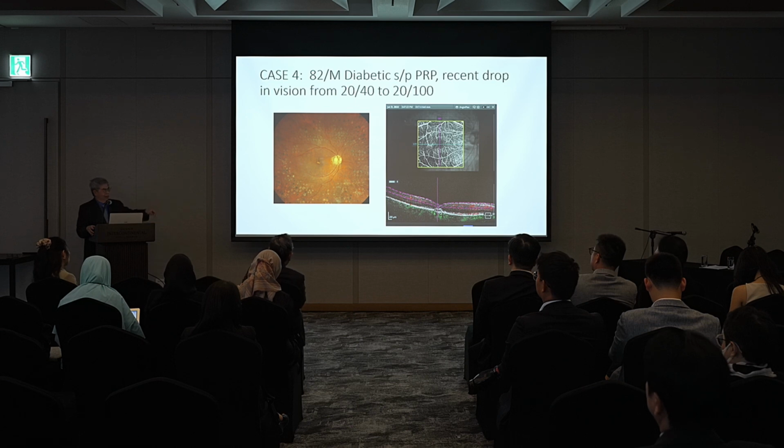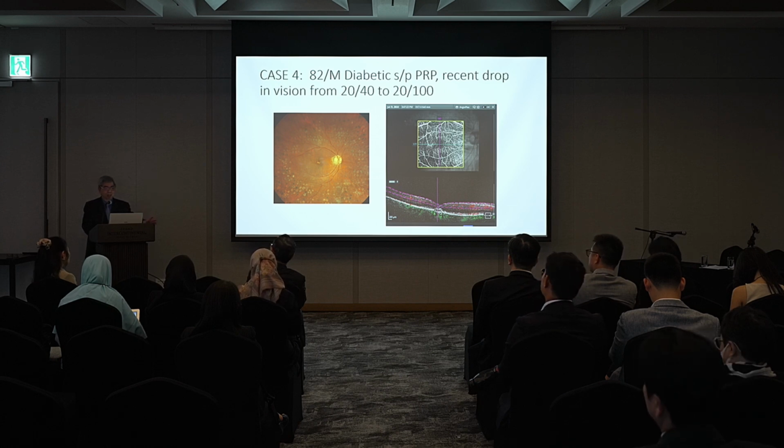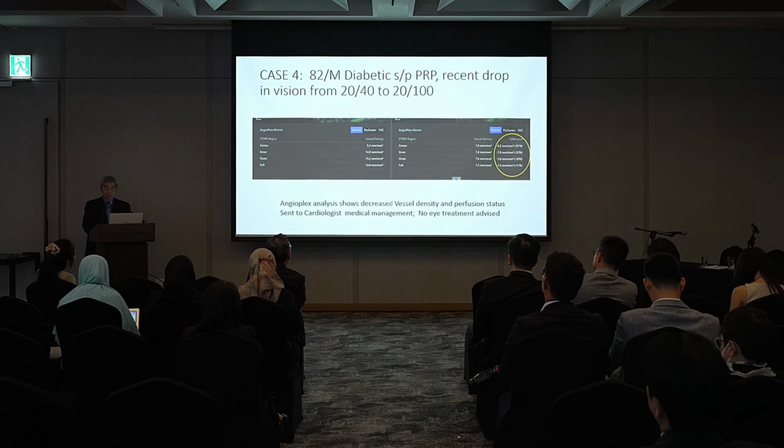Yes, that's a good point. And we actually looked very closely at the flow in that area, and we didn't seem to see any flow above that lesion. And that gave us a little more confidence to convince his cardiologist to start anticoagulant treatment. Plus, this was the good eye of the patient. The other eye was worse. So the patient was anxious to do something to get some useful vision back. And he was a prominent lawyer in the Philippines.